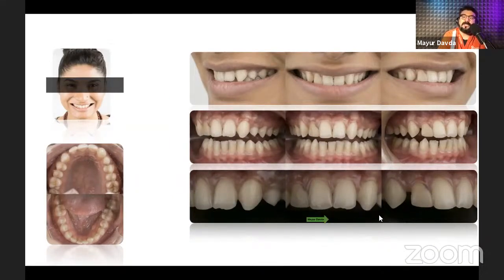So the black background that you can see over here is not photoshopped. It is with the help of a contraster. So you need to have a set protocol of which intraoral accessory also has to be used for which particular situation. Now coming to this particular image, that is the full arch occlusal image, which is probably a nightmare for most of the dentists I have seen.